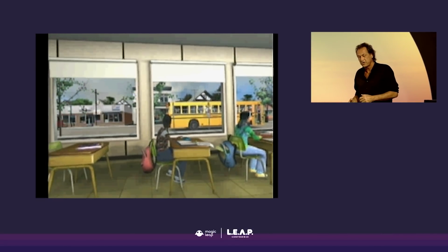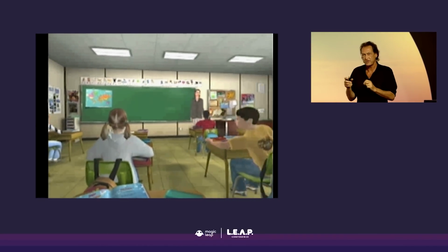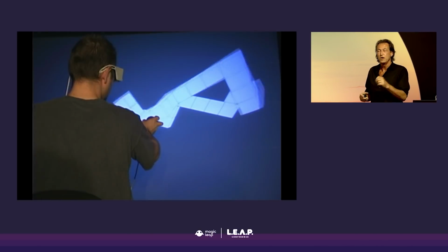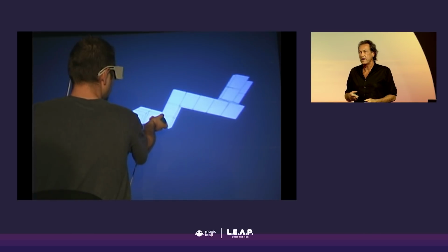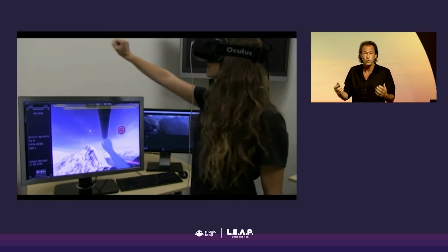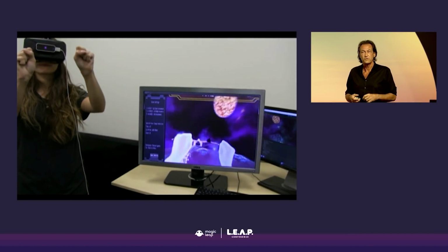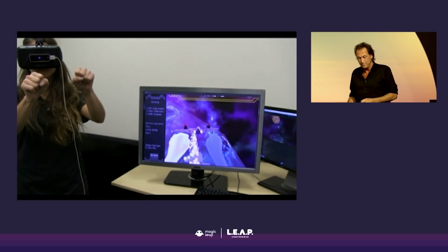Some more modern work that we've done with physical therapy, this is using a LEAP motion sensor, a different company, on a headset, where now we can track hand movement for upper extremity rehab after a stroke or traumatic brain injury, and we can build game-based rehab in these environments so that maybe we can make it so that people do more of the rehab, make it more engaging, and a lot of other factors that contribute to the benefit of that, but it's an important area to address.